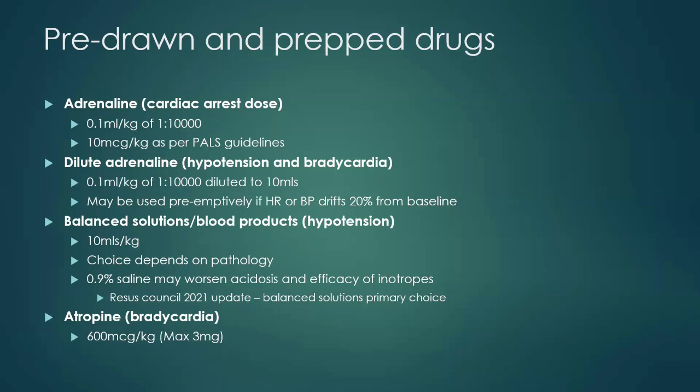I personally use Pedistat. I find that it's incredibly useful and it's very well and simply laid out. But I would not recommend that during such a stressful situation you're trying to do mental maths at the same time. So have someone dedicated to doing this and prepping it beforehand so that you once again just have everything there. You don't have to think.